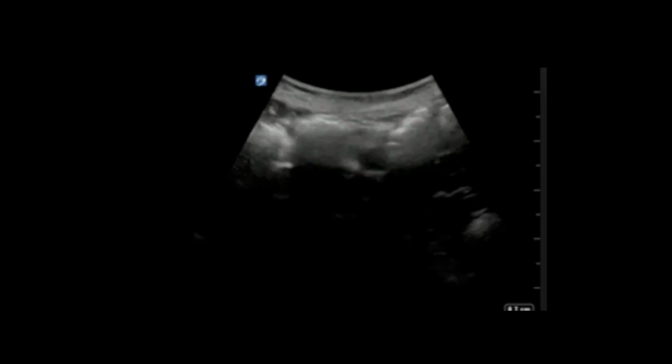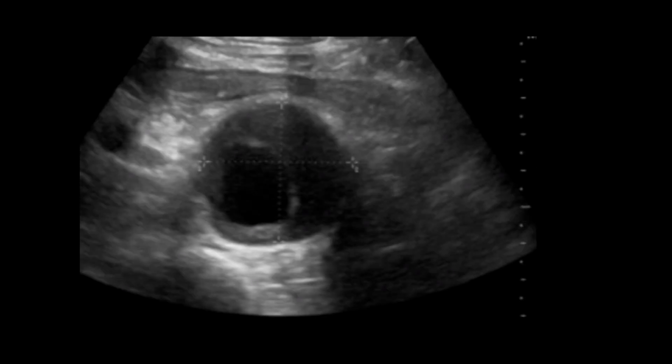If the aorta is measuring greater than 5 centimeters in diameter, that's an AP measurement, then one should highly suspect a ruptured AAA. Now, it may make you nervous to just presume a diagnosis based off of a measurement you have just taken, but if the rest of your RUSH exam is not yielding much and you have a hypotensive crashing patient, then pulling out all of the stops is okay to do to potentially save a patient's life. You can always call off the troops if this ends up being wrong.